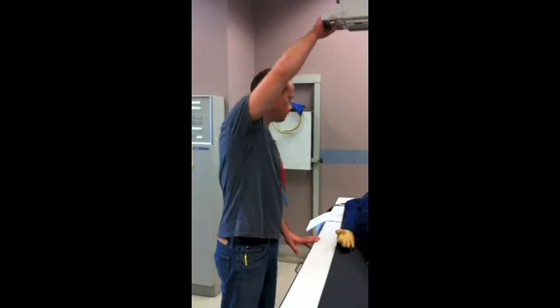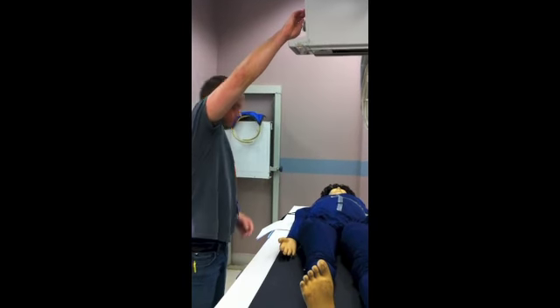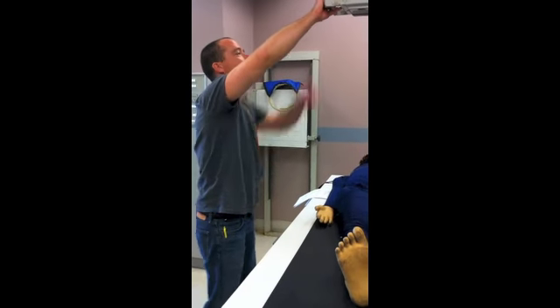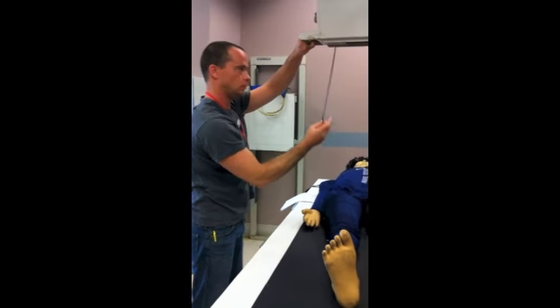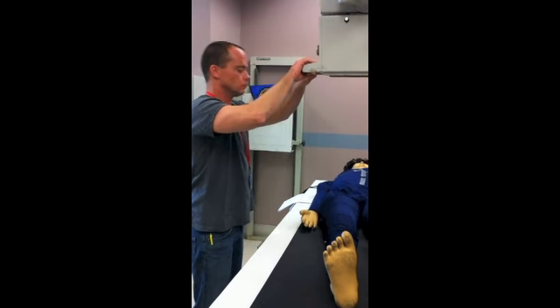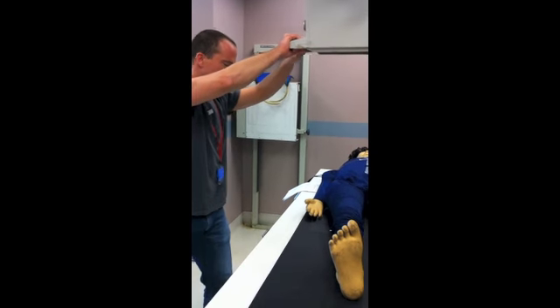SID is 40 to 48 inches. I like to do 40. Going to center to the middle of the table.